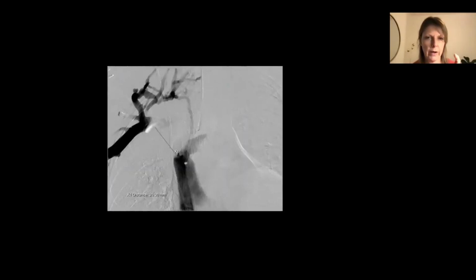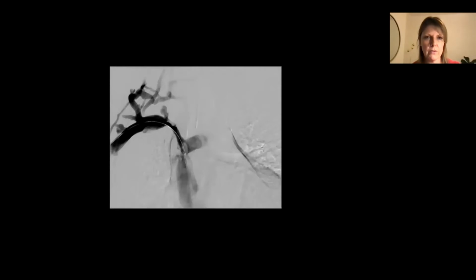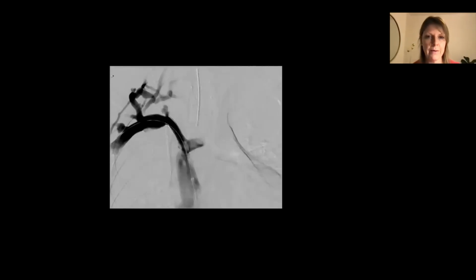We've managed to work out exactly the distance we need to cross. And with a bit of effort and a bit of good luck, we've managed to cross that stenosis with a guide wire. We've then put a metal stent in, I think you can just see there, and ballooned that up. And we've now got beautiful through and through access and normal venous return, not filling the collaterals, and now heading right to the right atrium.